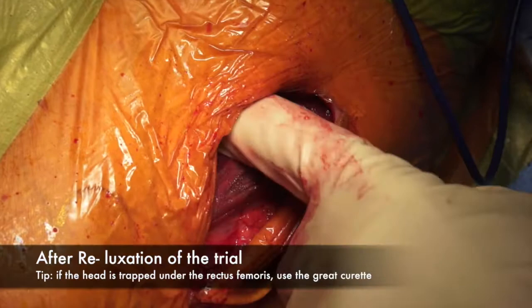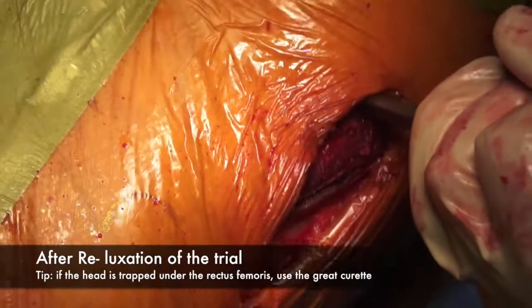After reluxation of the trial, tip: if the head is trapped under the rectus femoris, use the great curette.